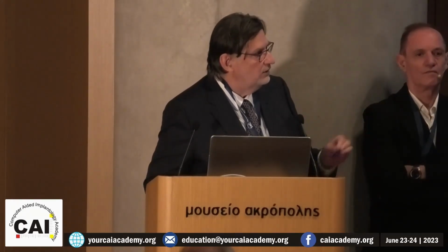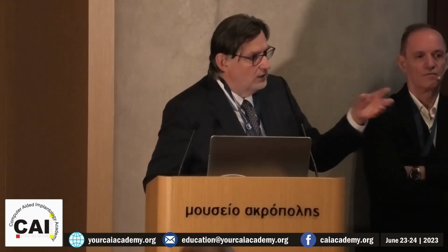So I think these are the types of applications we should look for. Not, as you said, give me a planning. What does it know about the patient? Nothing. Is he a bruxist or not? Things like that, the program doesn't know. It will give you a planning and it will be wrong. So this is the wrong question to ask artificial intelligence. The artificial intelligence is there, but we have to learn to ask the correct questions. I think this is what we, or the organization, have to learn.